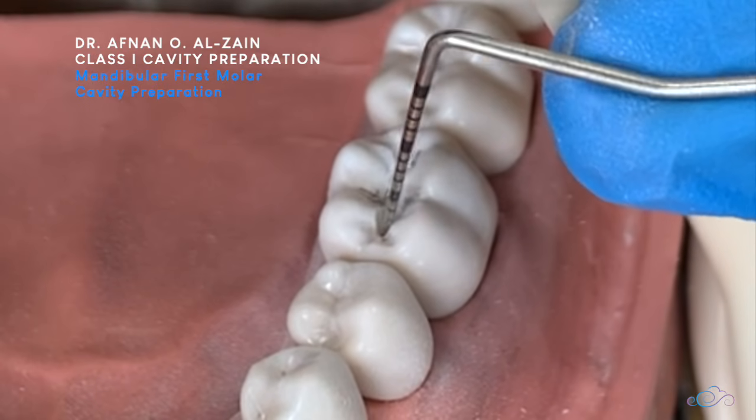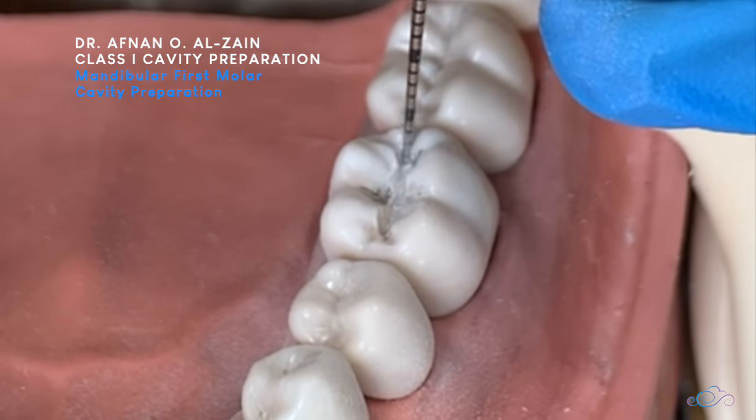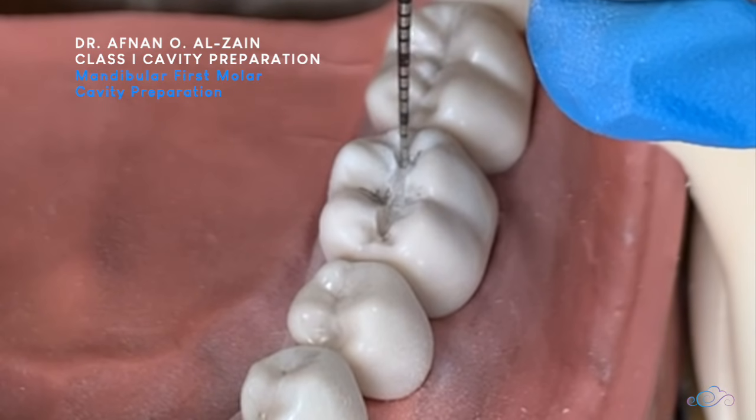With the surface margin, it is approximately 1.5 mm here. We'll go a little deeper on the distal side.